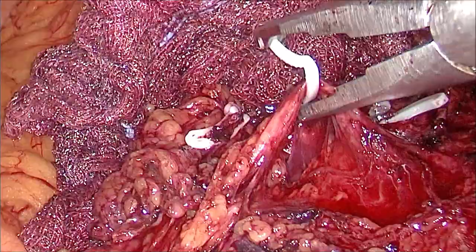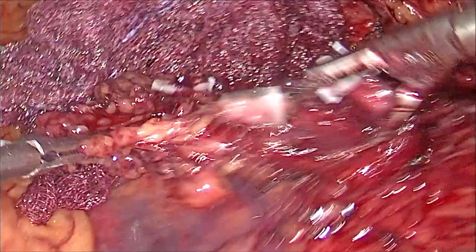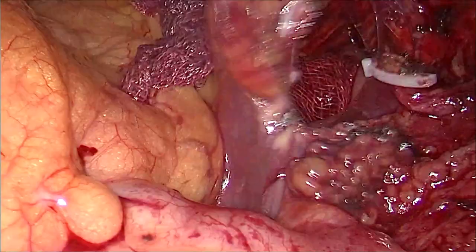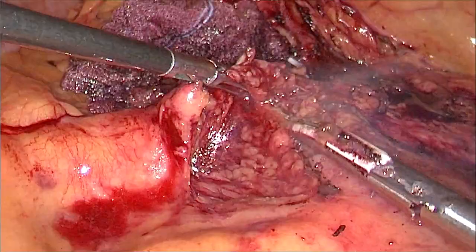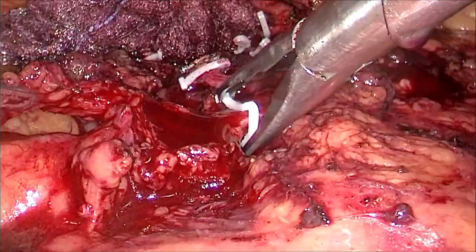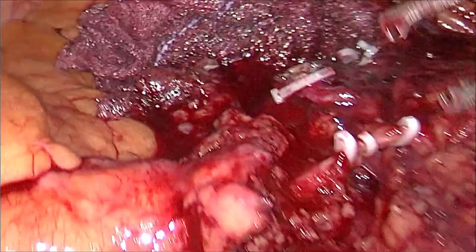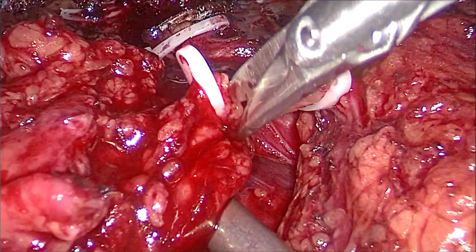Once this is done, we can take the artery and vein separately or together. The right colic vessels are taken together, clipped, and then divided. What remains is the ileocolic vessel. As we move caudally we can identify them, but remember this patient had bulky ileocolic nodes, so dissection was done proximal to them so as to avoid leaving behind any lymphatic tissue. The ileocolic vessel was skeletonized and all lymphatic tissue to the right of the superior mesenteric vein was taken with the specimen. The ileocolic vessels were clipped near their insertion into the SMV and then divided, completing the central vascular ligation.